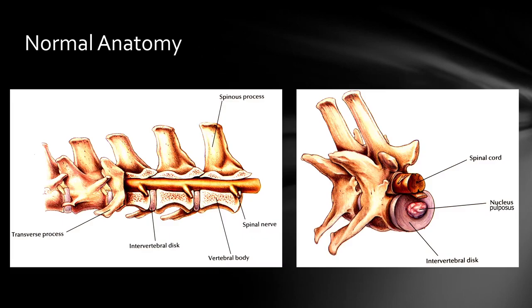When you look at the vertebrae anatomically, there are a few structures that are important and that we will also be looking for on our radiographs. So we have our vertebral bodies, and we will look at them on radiographs in a bit as well. The vertebrae are separated from each other by intervertebral discs, which on radiographs, because they are cartilaginous, at least in younger ages, will be more soft tissue opaque and will be sandwiched between the opaque vertebrae.